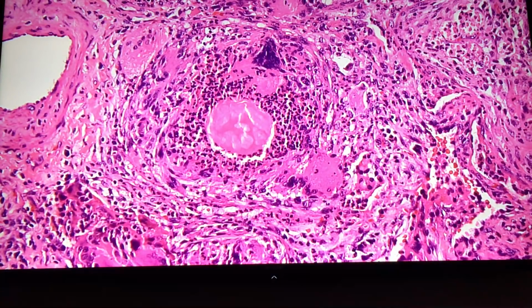Vegetables. Yes, this is vegetable material, aspirated vegetable material. In fact, this kind of structure is called a lentil, from how you get lentil soup. People in nursing homes get this because they can't swallow easily, so they get lentil soup. And for some reason, lentils like legumes are difficult to digest, and then they stay in the lung for a long time, and they make this kind of reaction.